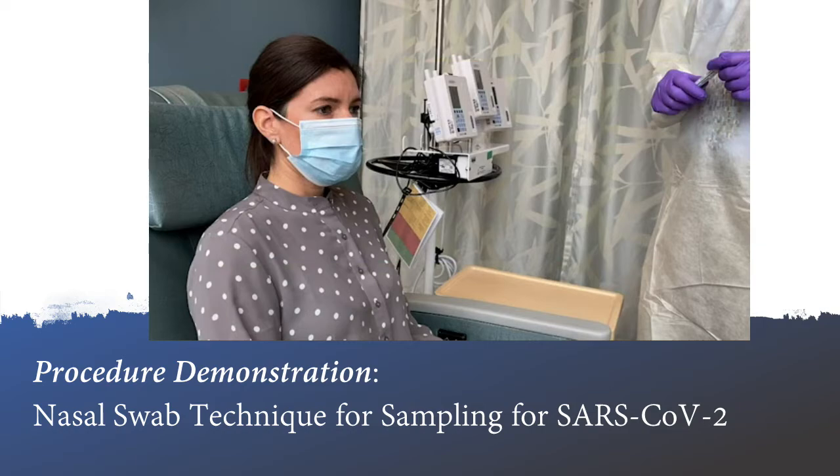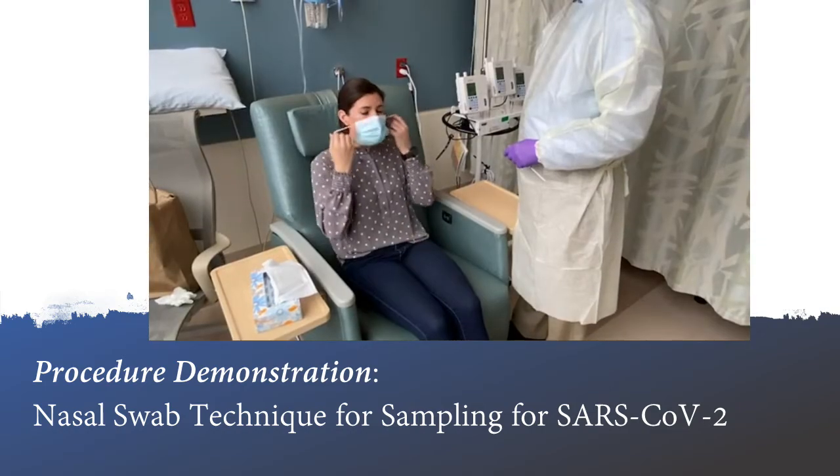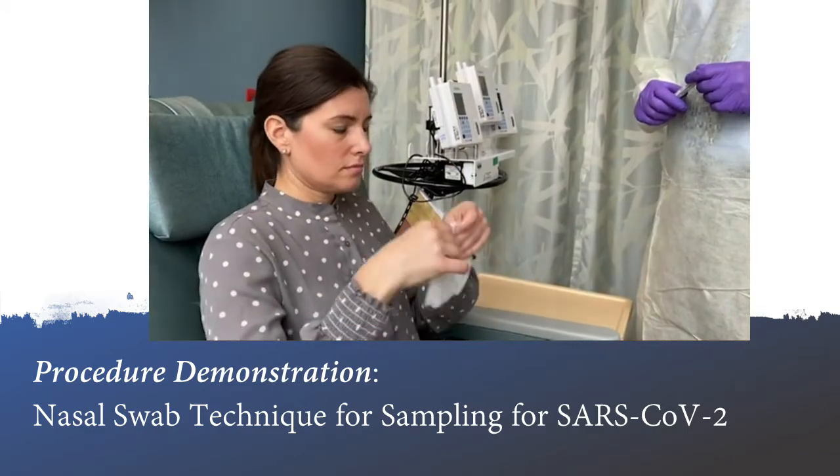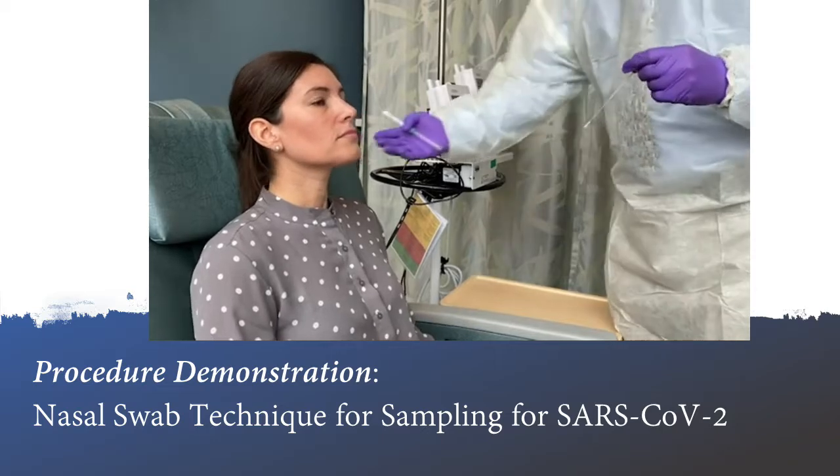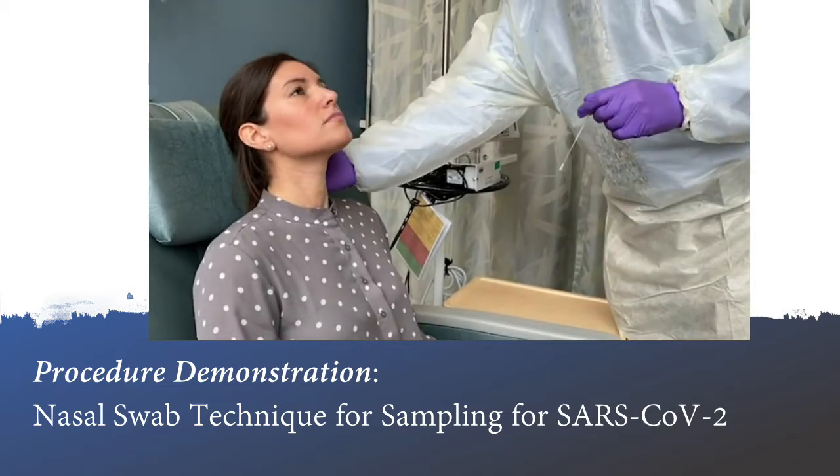Masks are recommended for all patients suspected of having COVID-19. Have the patient take off her mask and blow her nose into a tissue to clear excess secretions from the nasal passages. Remove the swab from the packaging. Tilt the patient's head back slightly so that the nasal passages become more accessible.